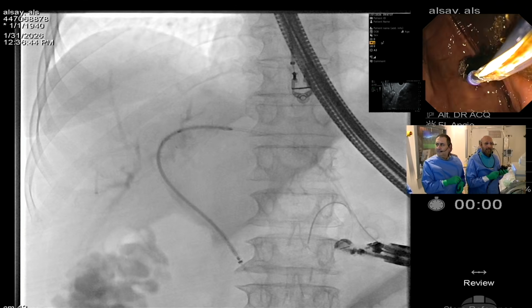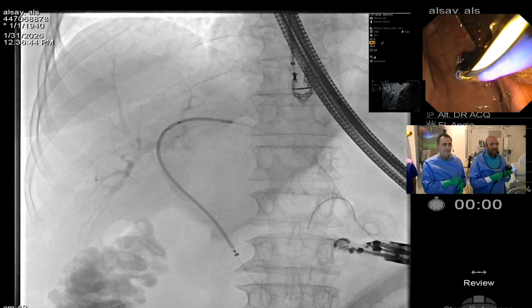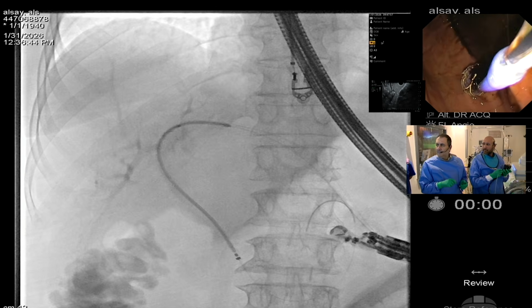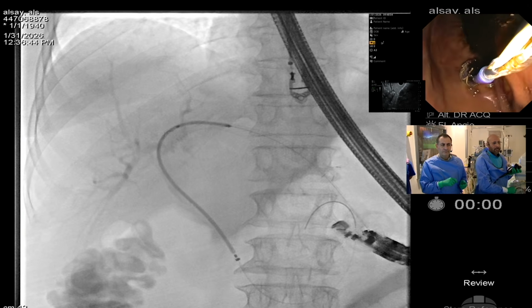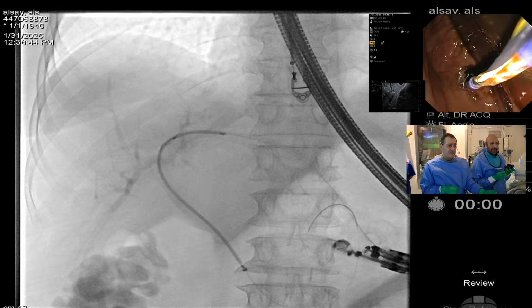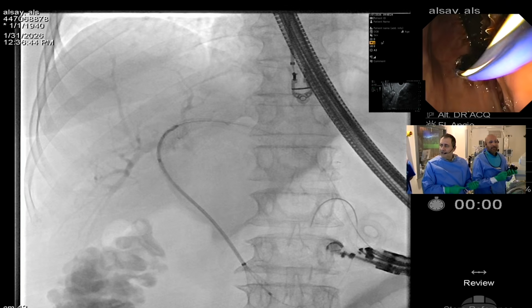Look. There's a resistance because on bute contre la sténose tumorale. Mais on va essayer de revoir. Without a contrast, we cannot really tell if we pass the ampullary area or not. Yeah, I know. I mean, we can try to see if the stent can be opened here. Okay, can try. 1 minute, please. If we cannot pass this stent, we cannot pass it. That's it. Double pigtail. Okay.